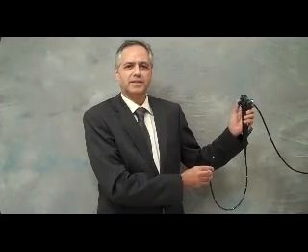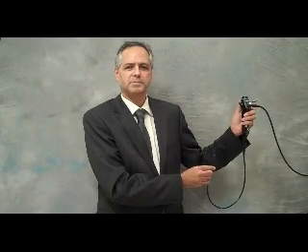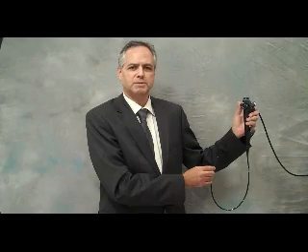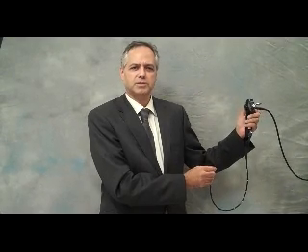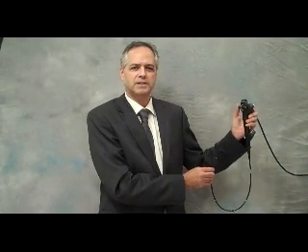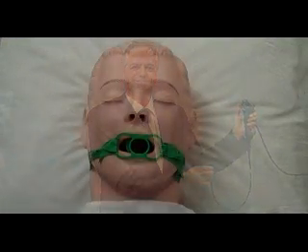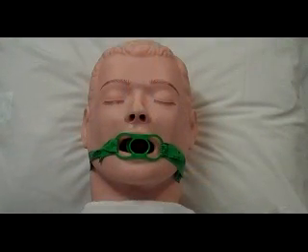My name is Henry Colt. This is a flexible bronchoscope. During the next few videos, my colleagues and I are going to demonstrate how this instrument can be used to inspect the airways and make a diagnosis in a variety of lung disorders. I can perform bronchoscopy from the head of the patient or from the side of the patient.